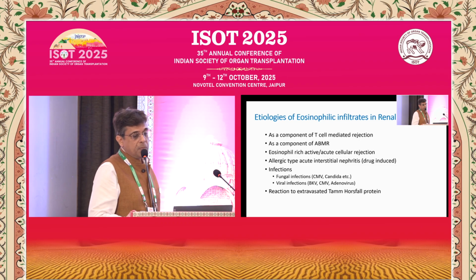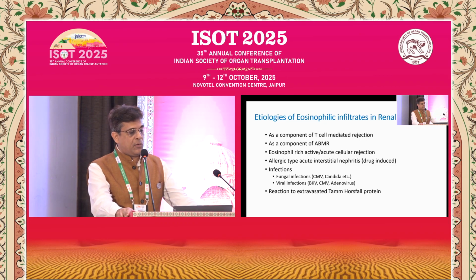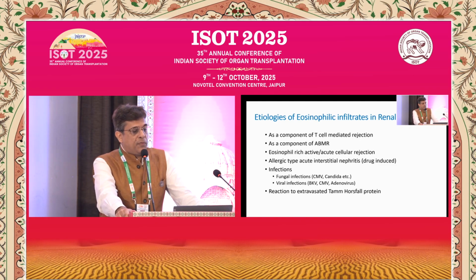Now, if we just take an overview of eosinophil infiltrates in the renal allograft, this would be the broad heading. It can occur as a part of T-cell mediated rejection.